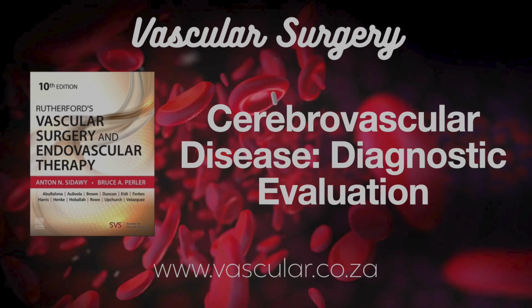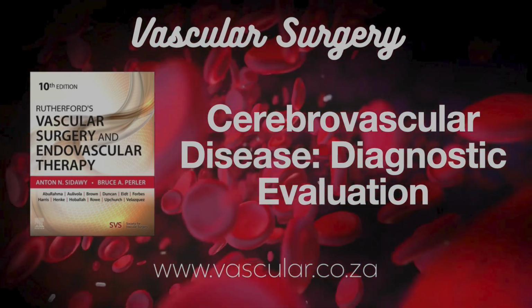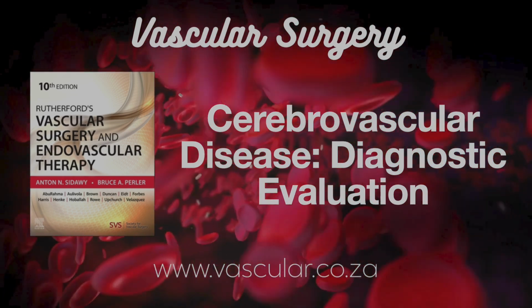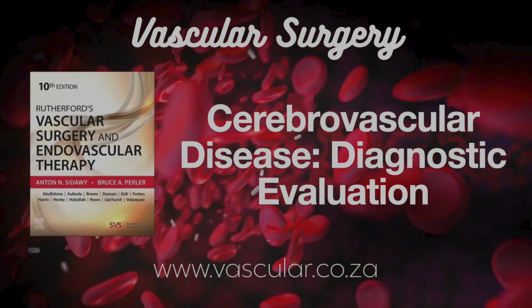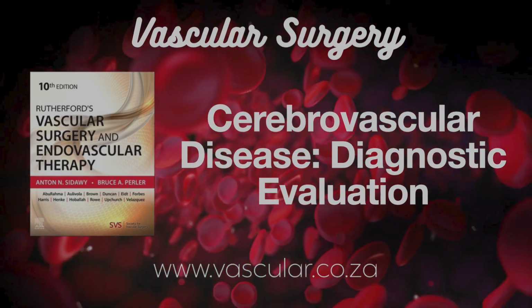Ah, that's different. Planning for stenting, whether it's transfemoral CAS coming up from the leg or TCAR with direct neck access, requires much more detailed anatomical information than CEA typically does. Why so much more? Because you're navigating wires and catheters through the entire system for CAS, or dealing with specific access site issues and flow reversal for TCAR.